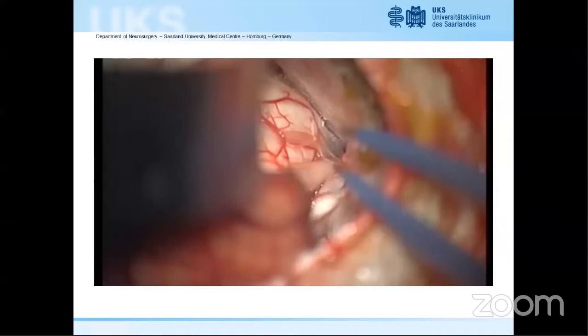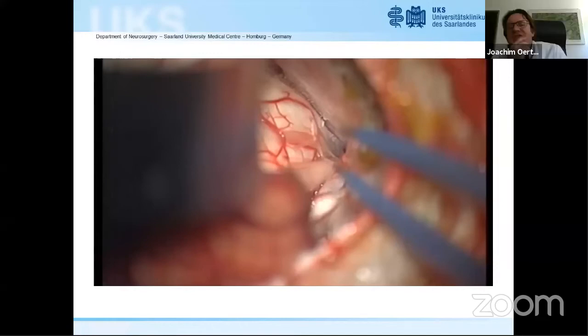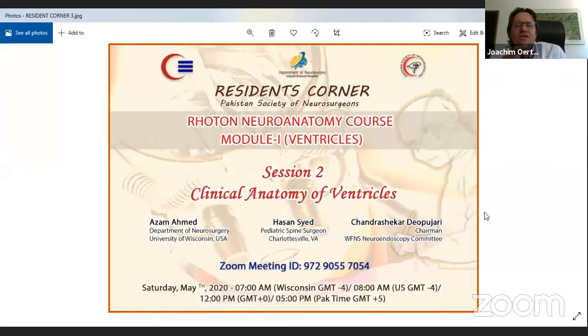Transcavernous surgery is a very, very risky surgery in any case. So if you have different options, the safest way is to come from posterior. If you have the usual standard lesion in the brainstem, you come by the suboccipital midline approach. Then the next most likely approach is the one we have seen today, the retrosigmoid. And some use an endonasal transclival approach, but this is already quite difficult. Transcavernous approach, I don't think that this plays any role in the treatment of these cases.